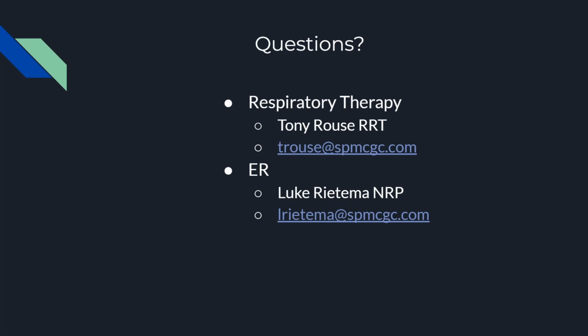Stick around now. I'm going to show some video and talk over where I'm actually operating the vent. It's going to show you all the same stuff that we just went over. And, well, I'll see you guys around the ER.